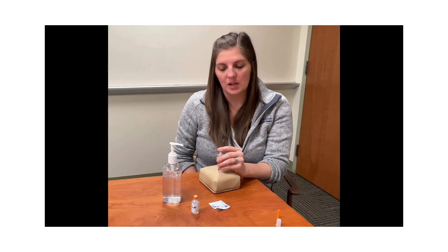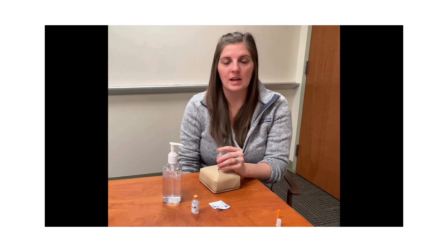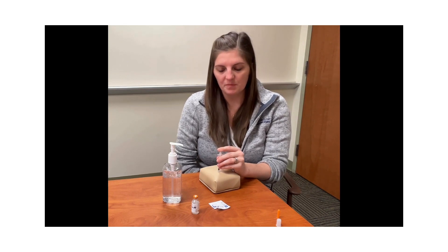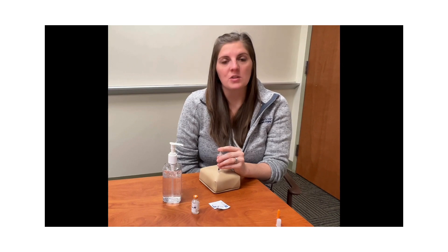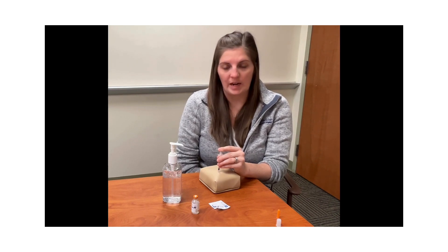Once all of the insulin is in your skin, you are going to hold for five to ten seconds, allowing that medication to absorb into your skin. When you are ready to pull out the needle, you will pull it out at the same angle that you put it in.